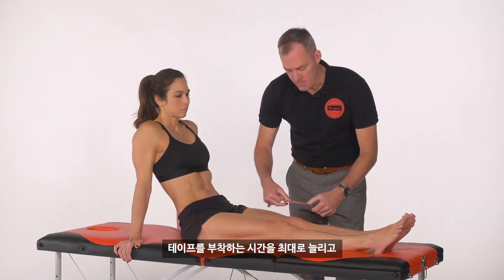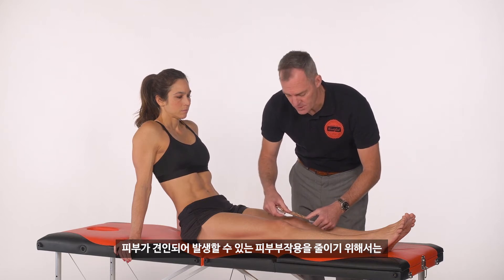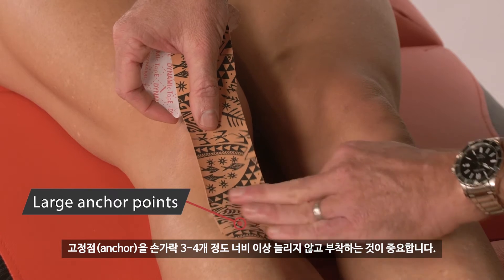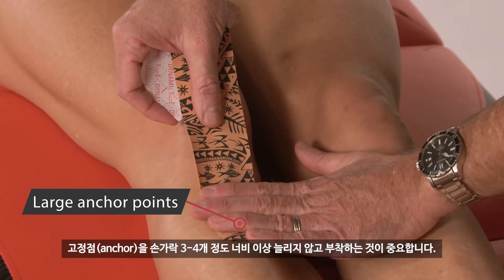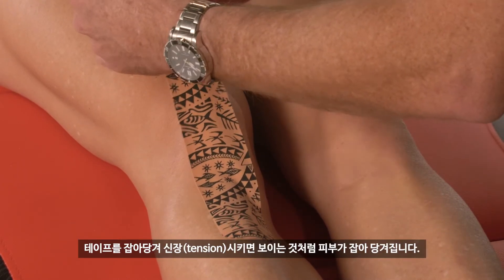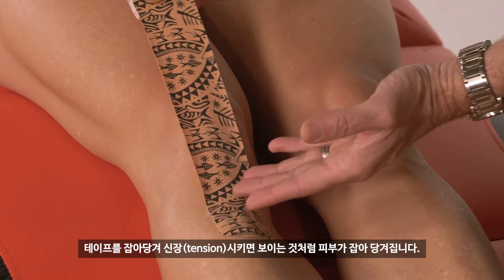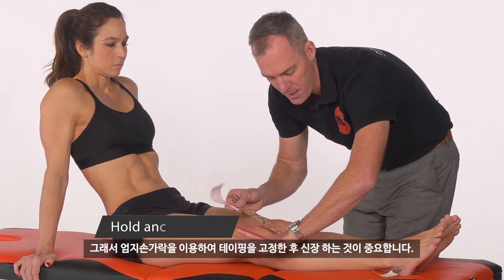To get maximal wear times and to avoid mechanical irritations, or what we call traction blisters on the skin, it's important to leave an anchor point that's got no tension — generally around about three or four fingers width. When you apply your tension, don't just pull on the tape, as we can see here it's shearing on the skin. So it's important to hold down using the thumb.